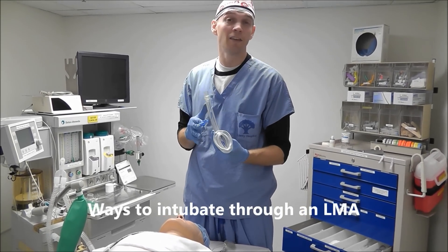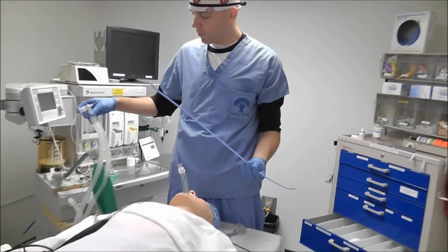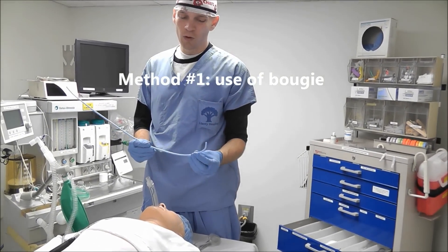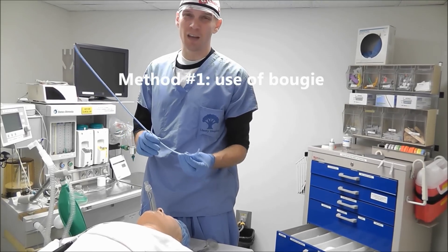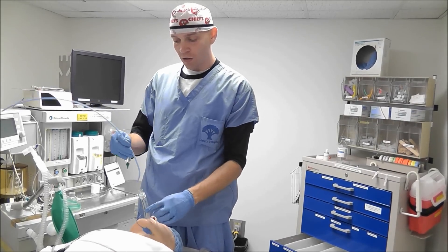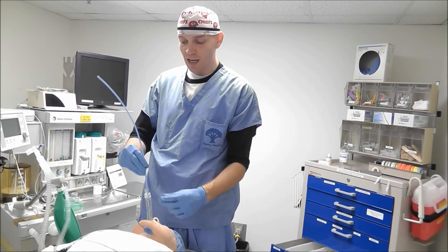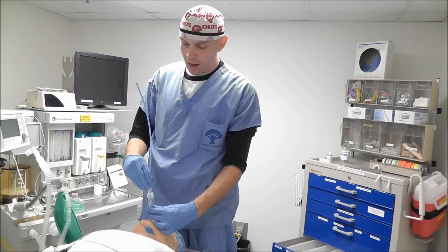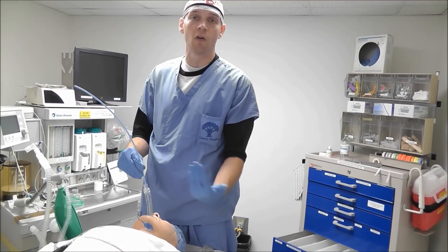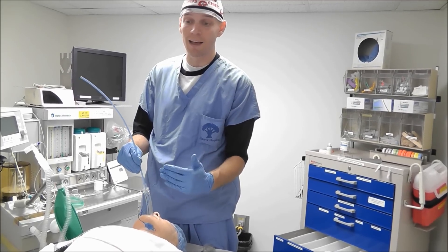Today we're going to talk about how you can intubate through an LMA. One option I want to mention but don't recommend is use of a bougie, and this is really only what I would recommend in an emergency. Because this is blind, we may have a chance of passing the bougie into the vocal cords, but you have a high chance of going inferior or lateral to the glottis. You can cause a lot of trauma if it's blind like this.